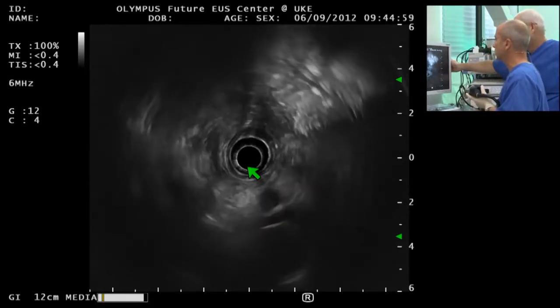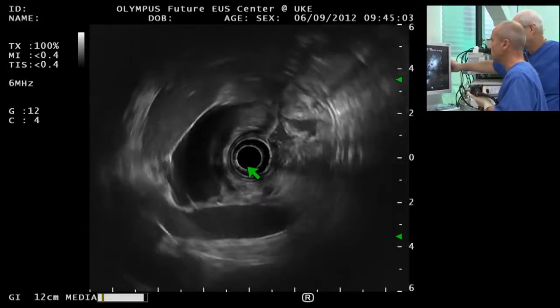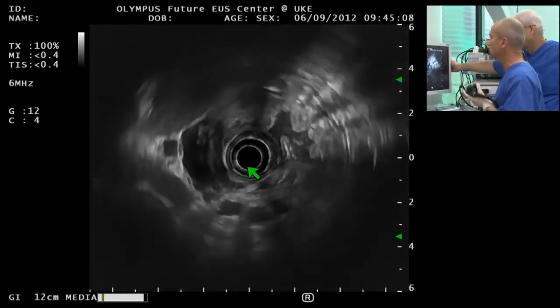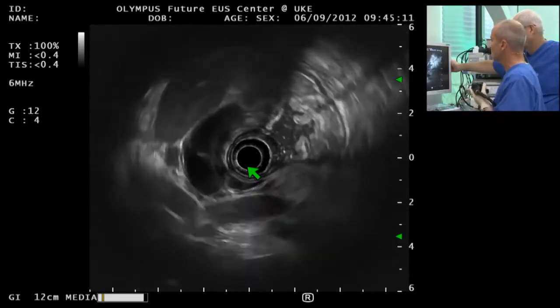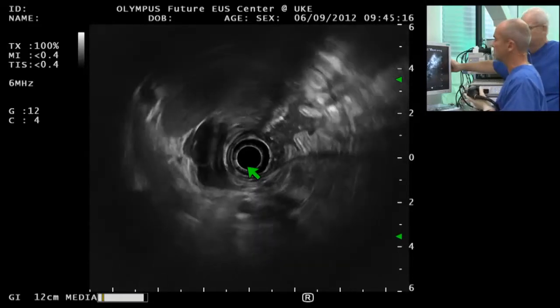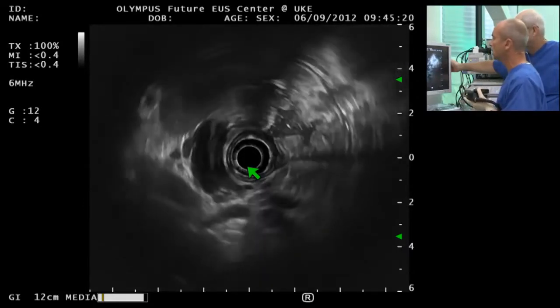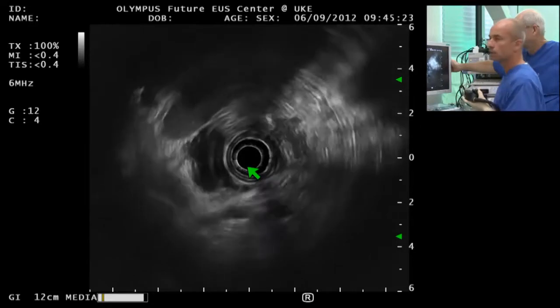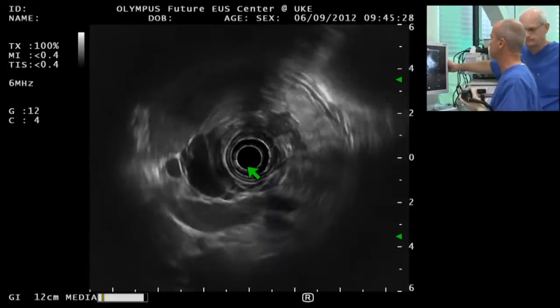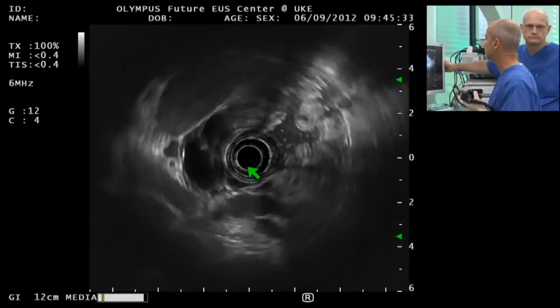So, in our opinion, it's of course a benign cyst. You see that there is nothing inside the spaces, no vegetations, no mural nodules, no tissue around it. So it is outside of the pancreas, and we were discussing FNA, but we think that in this situation FNA will probably not add any information, and we could have some risk of infection. So we were not in favor of doing an FNA in this situation.